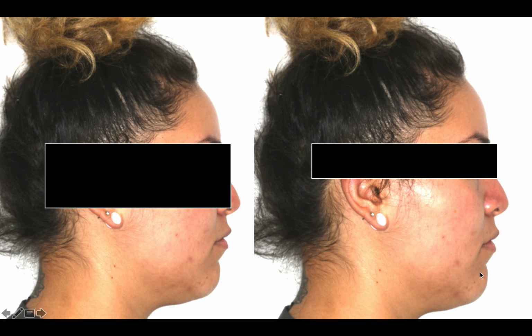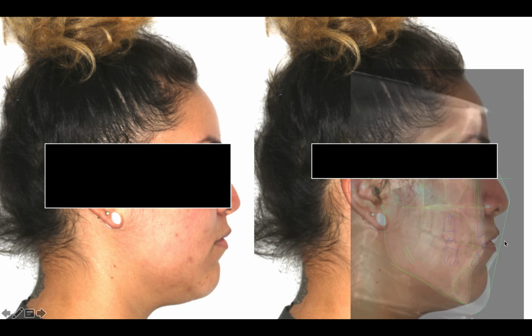And what you'll see is if you look at the shape of the lip, you can actually see that she has an incompetent lip closure. And we really have too far of an angle here. So if we overlay that CBCT tracing, and again, sorry we can't see all of it, we're just protecting the patient's privacy here.